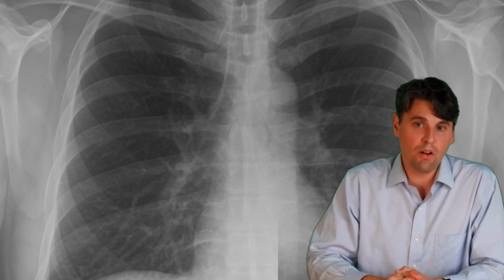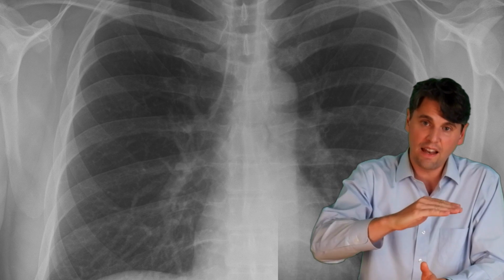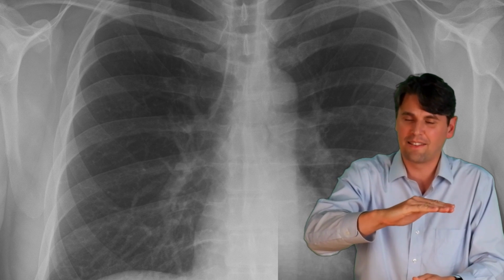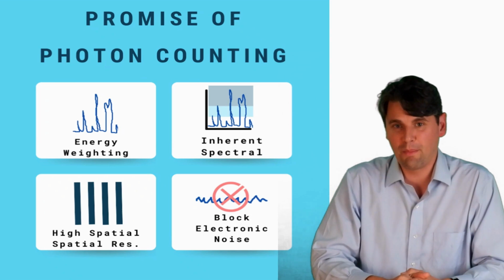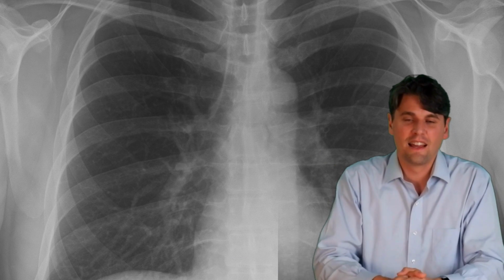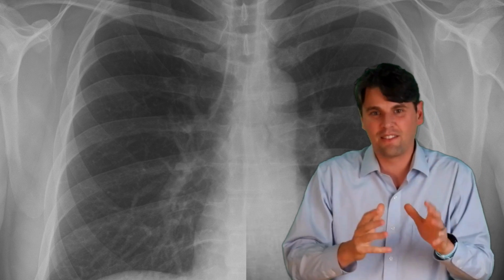Photon counting in general allows you to have the different bins like we talked about, and allows you to set an energy threshold, a minimum threshold below which counts are ignored. That can suppress the electronic noise so it doesn't contribute to our image signal at all. So these are the promises of photon counting CT. Watch the vendors to see what comes out over the next several years and see how photon counting CT starts to play a role more and more in clinical imaging in CT.